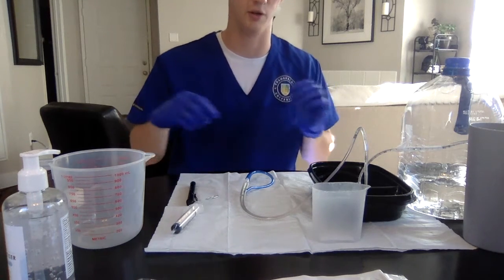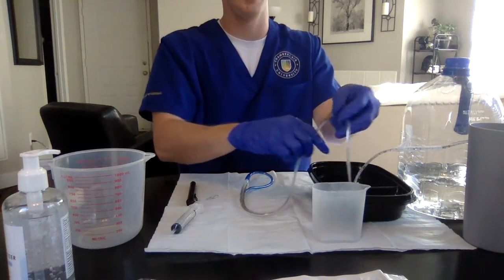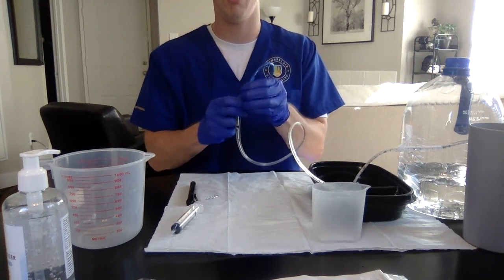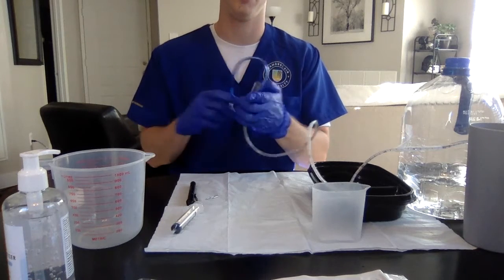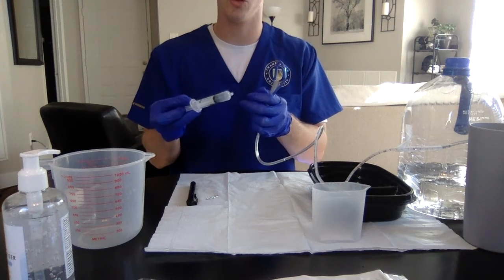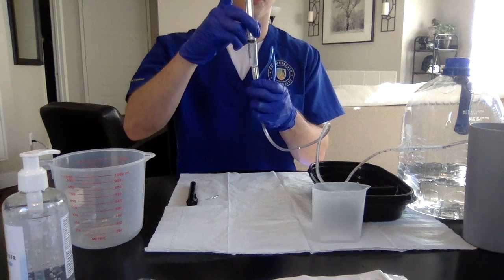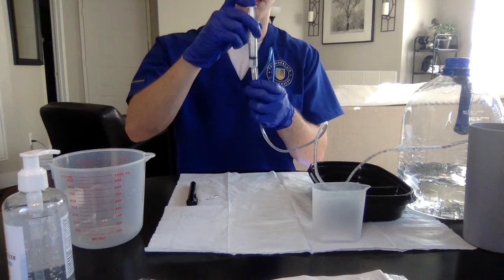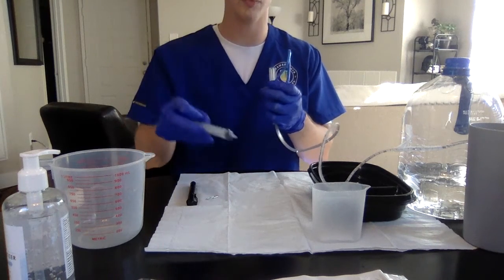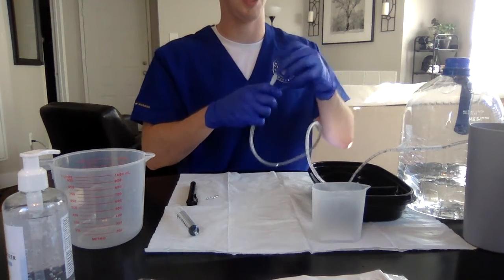So we've done the hand hygiene and new gloves. So now what we're going to do is remove our paper clip from our client's gown, have it hanging down like this. And the next thing we want to do is take our clean syringe and we're going to fill it with about 20 mLs of air. And then we're going to push that into our tubing. And that's to make sure that any gastric contents that may have been left in the tubing is going to be flushed out. So now that that's all done, we can insert this back here.